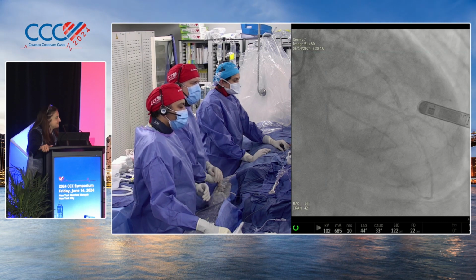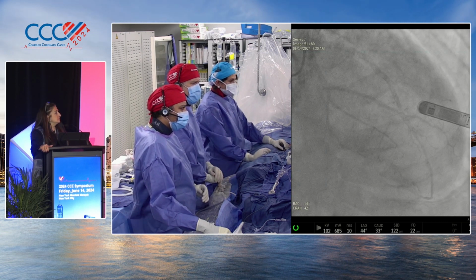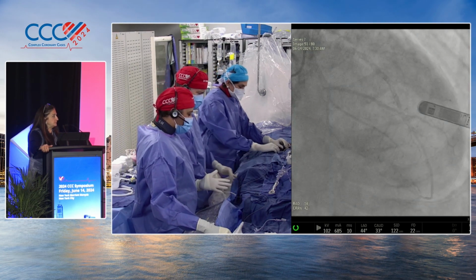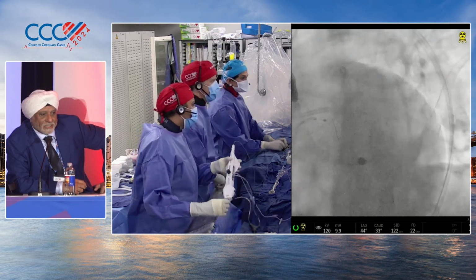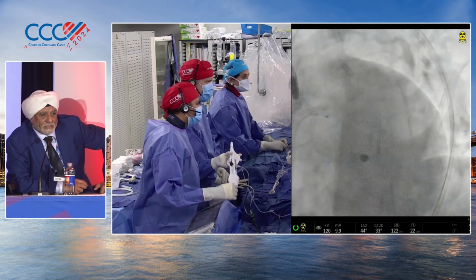Yeah, that's great. Dr. Singh? Yeah, no, I agree. I think these patients are the ones who have very, very poor reserve. Even the groin, if they waggle, they spiral down and come back. So here, if you're thinking about performing atherectomy, which you probably will, I think support here is important.